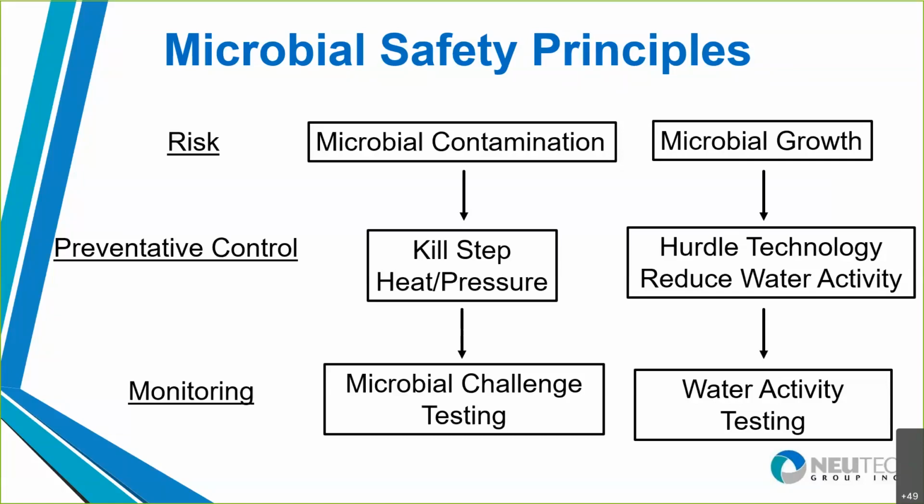And so in terms of monitoring each of those individual potential risks, the monitoring for microbial contamination comes through microbial challenge testing, basically testing the product to see if there are organisms there. On the hurdle technology and water activity side, the monitoring happens through, of course, water activity testing.